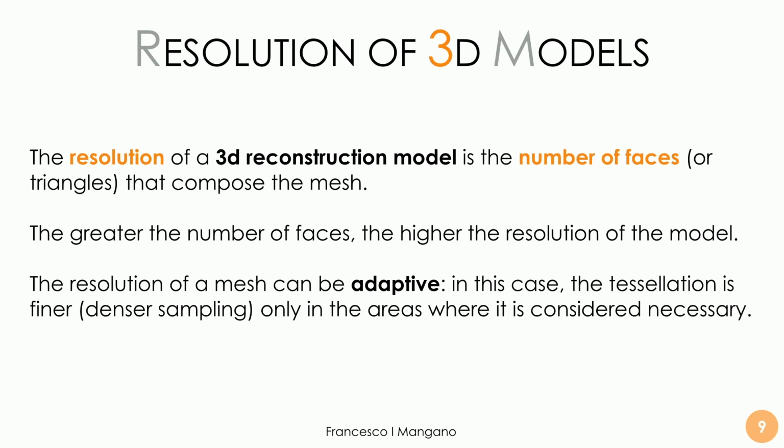They collect a lot of information, they send this information to the software, and then it's the software that really makes the difference, because the software can decide to pick up more or fewer points and then to generate more or fewer triangles. And then we can have a resolution of acquisition that can be lower or higher, depending on the choice of the software. And let me say that the resolution of acquisition has almost nothing to do with the trueness. So we are talking about something different.